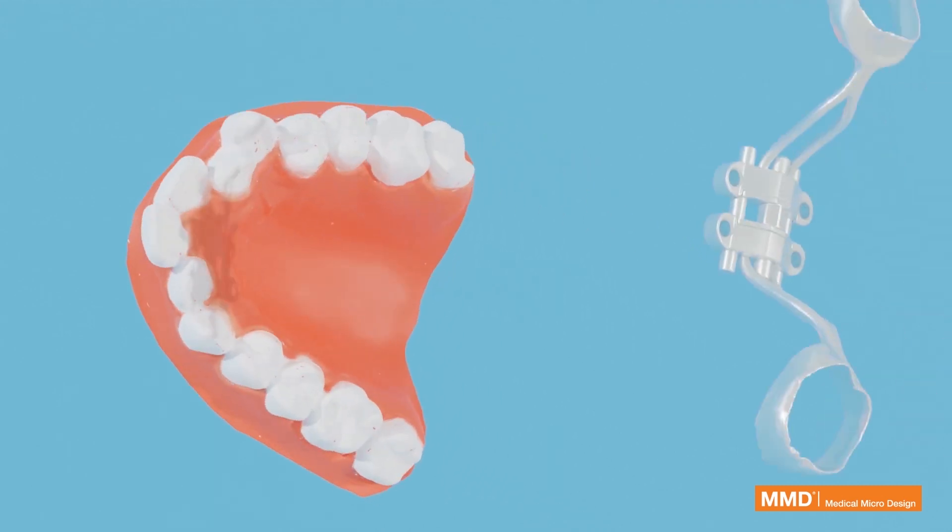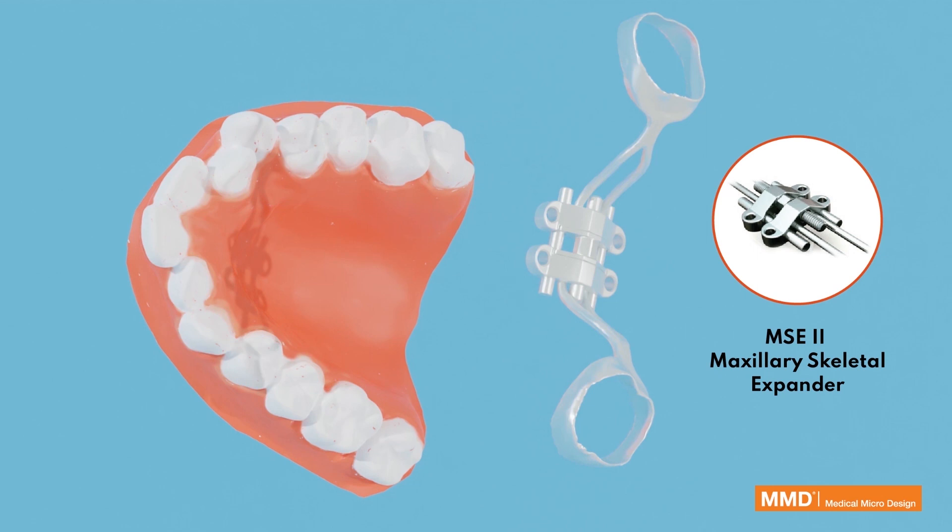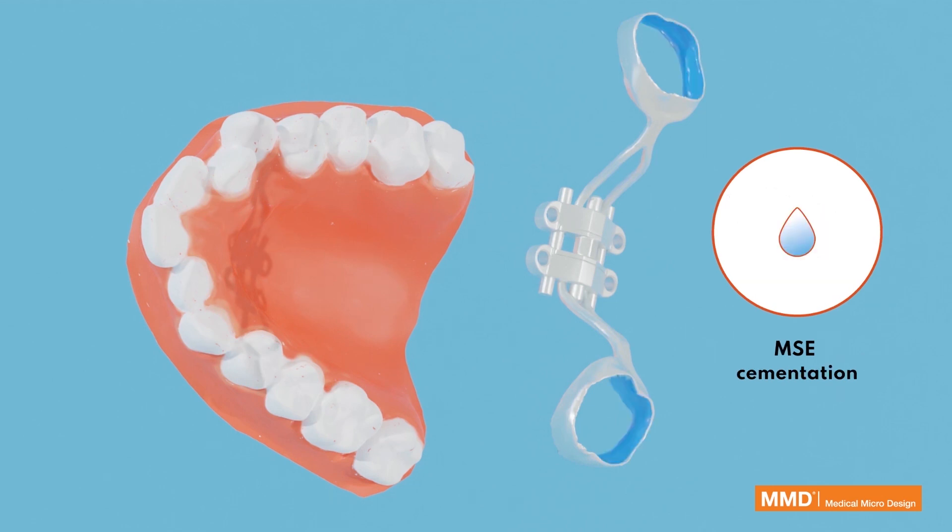MSE positioning with electric screwdriver. MSE 2 Maxillary Skeletal Expander — MSE cementation.